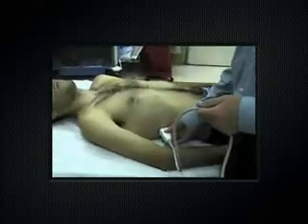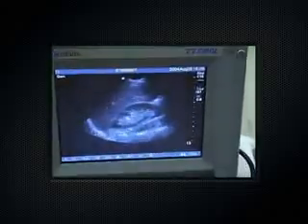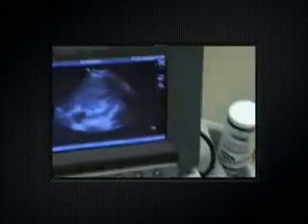Now if we talk about the renal scan, you pretty much did one during the FAST exam, but you come over here and you get a nice coronal view of the kidney. You can actually get the kidney upper pole and lower pole on the screen at the same time in a long axis, and if you rotate the probe 90 degrees you can get a short axis of the kidney. Rotate the probe towards the ceiling, you get a short axis of the kidney fanning through.